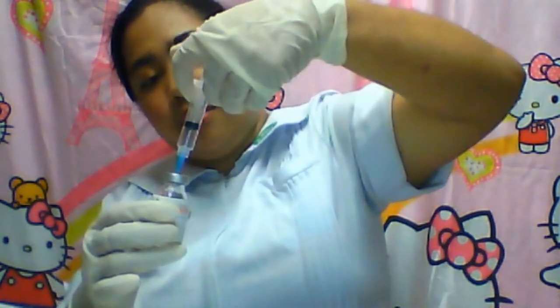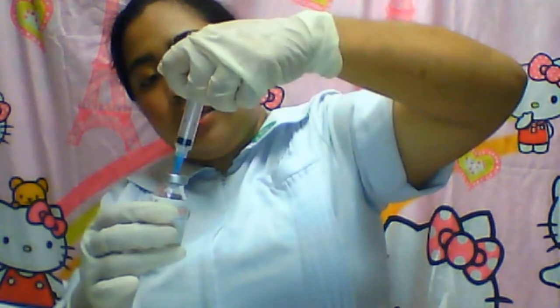There we go. Introduce this air into the vial. By doing so, we are actually preventing the pre-vacuum that is sealed on the vial — we will be preventing the air from coming back through the syringe, which would actually hurt the patient. Once you introduce the air, you flip your vial this way at eye level.